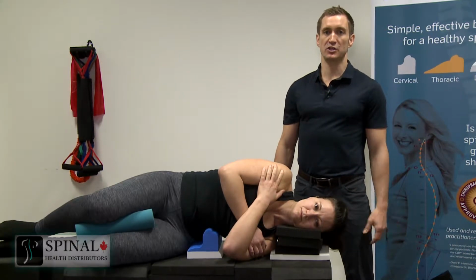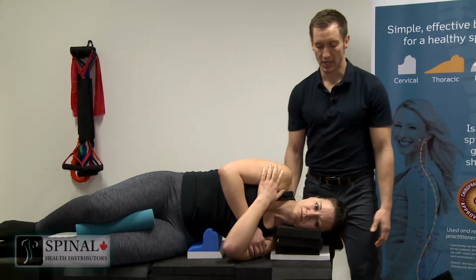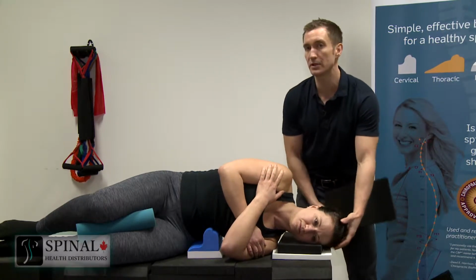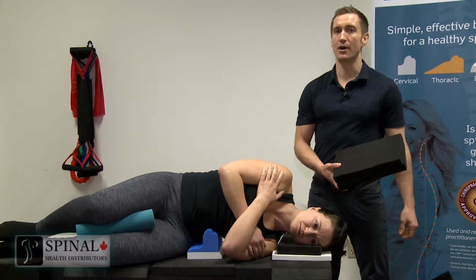Now, if my patient had a large right head translation, so the head was shifted to the right in their standing posture, and we wanted them to traction their head left, we could simply give them a smaller pillow or less support at home so that their head translates or shifts left while they're laying on the Scoliroll.